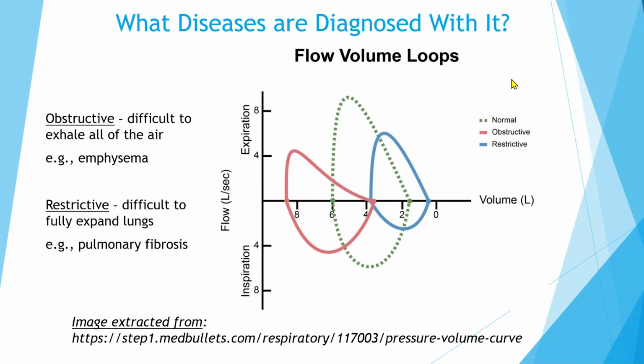Note that, as demonstrated in these sketches, the heights of the flow volume loops are typically lower with pulmonary diseases, as such diseases tend to reduce how forcefully one can breathe, thereby reducing both the peak expiratory and inspiratory flow rates. It should also be noted that, in the case of restrictive diseases, the flow volume loop is essentially a mini version of a normal loop, but shifted to the right, that is, toward smaller lung volumes. Now, John will talk about how this relates to impairment rating.